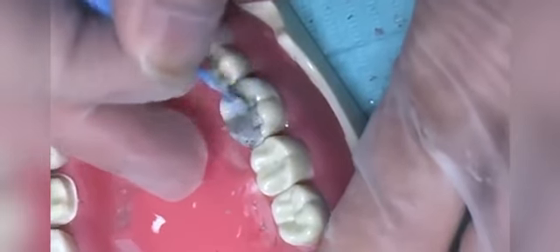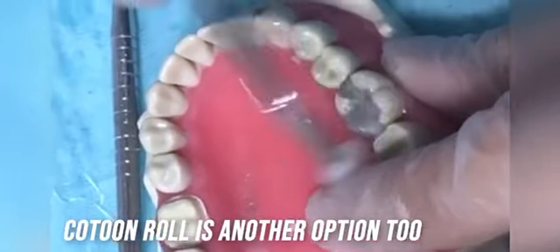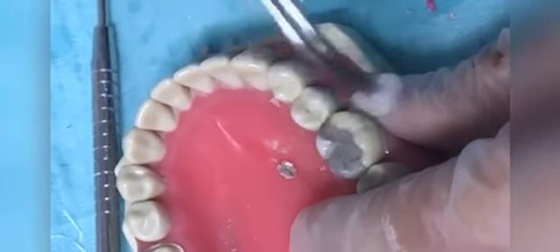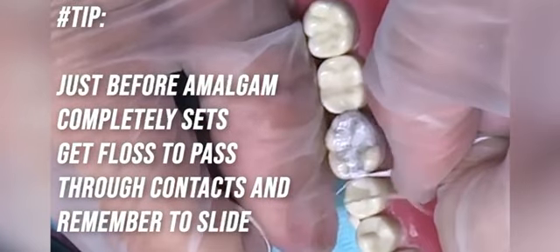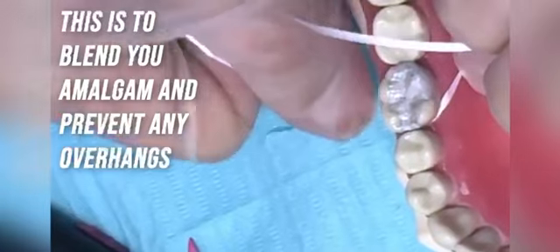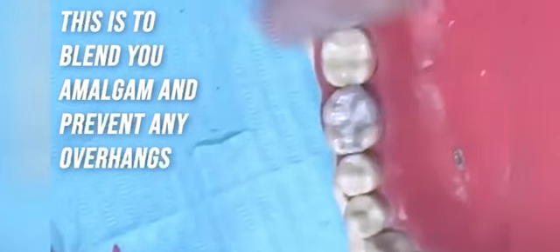So in the end, double check all the criteria, whether your marginal ridge height is equal to the adjacent teeth or not, whether the cusp height is okay or not. One of the criteria is maintaining the cusp contour. So you need to get the two slopes while you are making the cusp. And there should not be any ditches. If there is any ditch, just take the amalgam which is not set, add a little extra, and condense on that part only.